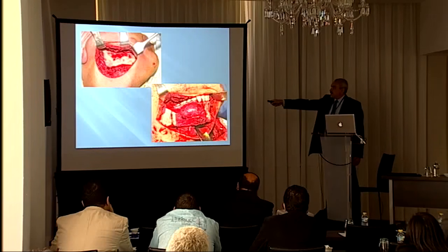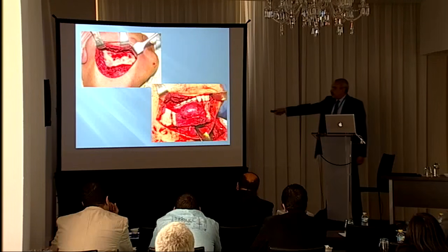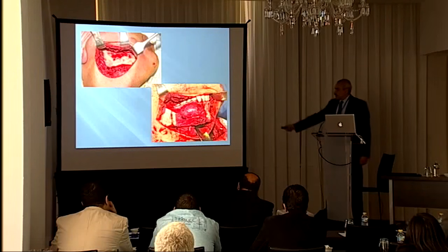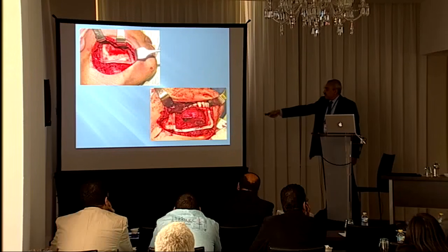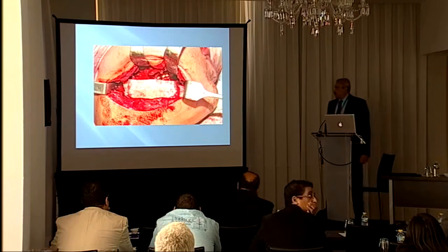We do here a submandibular incision, and this is a subperiosteal dissection plane. When the lesion is perforating the cortex somewhere, we do a supraperiosteal dissection plane and leave the periosteum on top. Then we place the resection template, and it fits perfectly well. Then we cut from here to there, exactly the same as we did on the modeling on the computer.